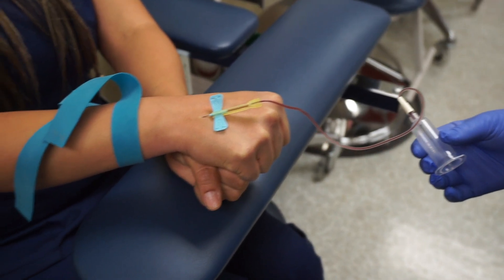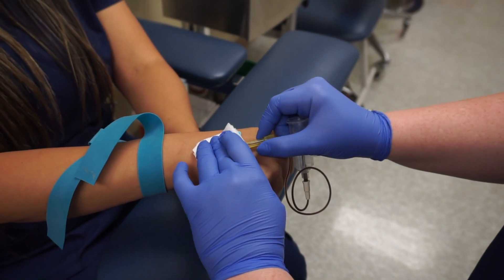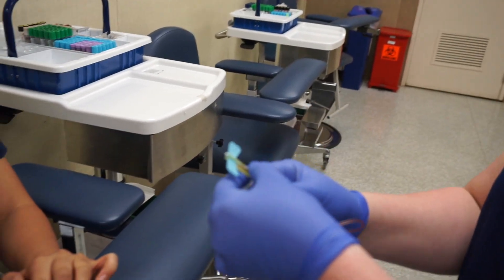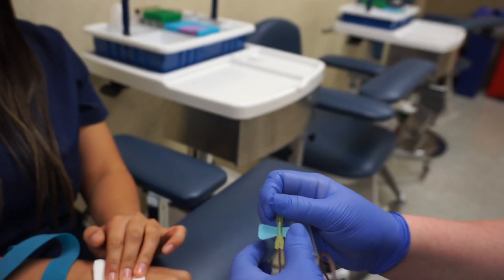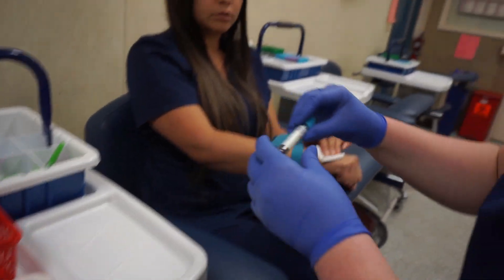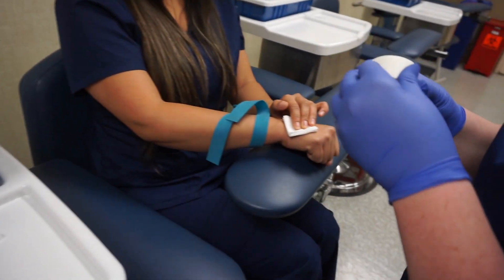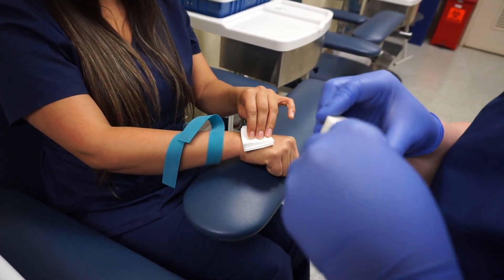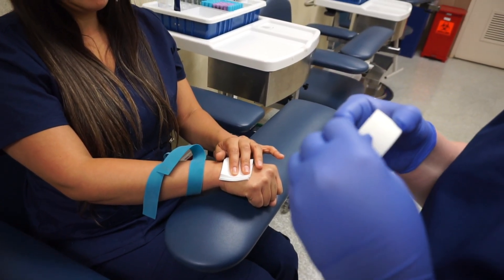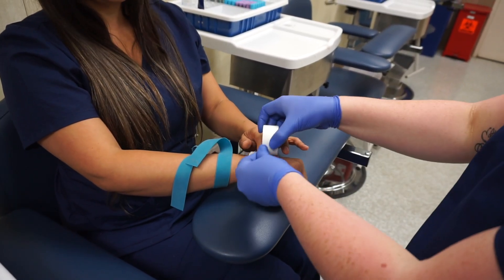Release the tourniquet. Pull out your tube. Grab your gauze and go over the needle, then pull out. Ask your patient to apply pressure. Can you apply pressure for me? Yes. Then you're going to lock your needle by pulling up on the yellow. This is always going to go into the sharps container. Ask your patient: can you verify that that's you? Yep. Perfect. Put it away. Then grab your tape and tape your patient just like that.